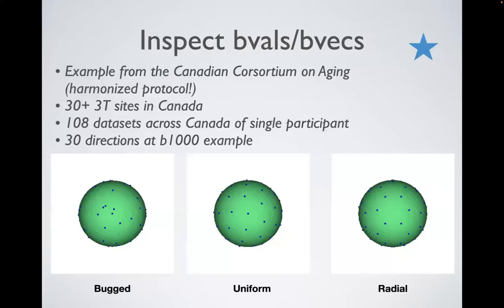Okay. First thing you need to be aware, depending on your MRI, not all MRI can measure the directions properly. So the first thing I tell students is check how your directions were acquired by the machine. Visualize your gradients, like these colors I was putting on my MRI machine.